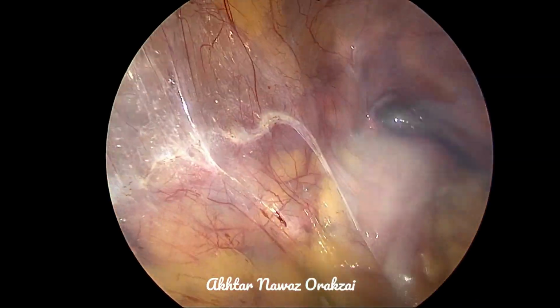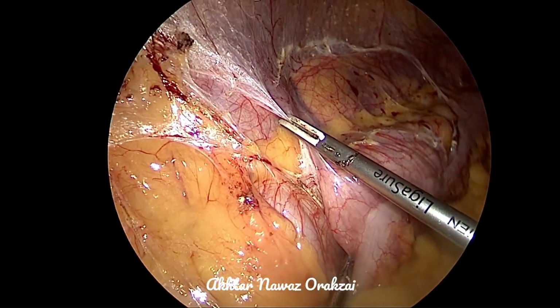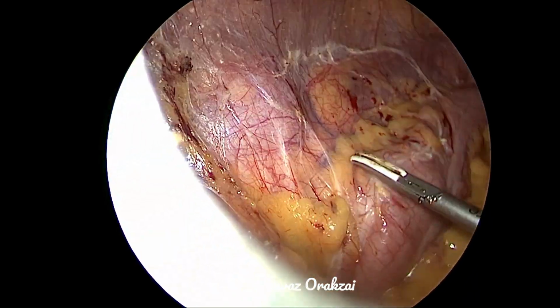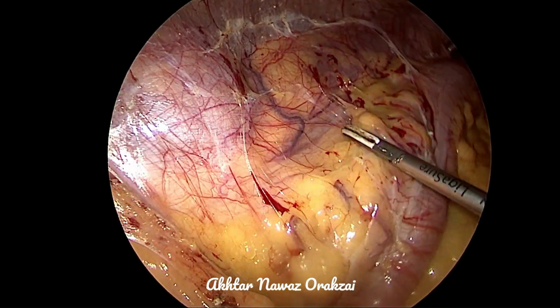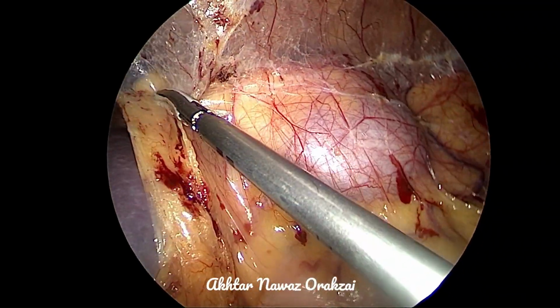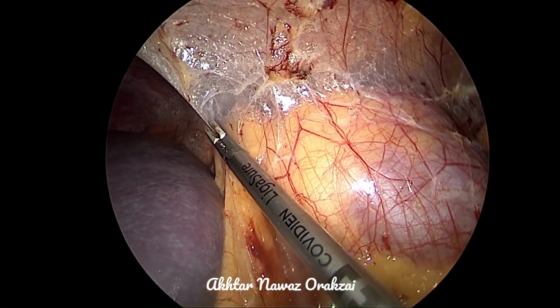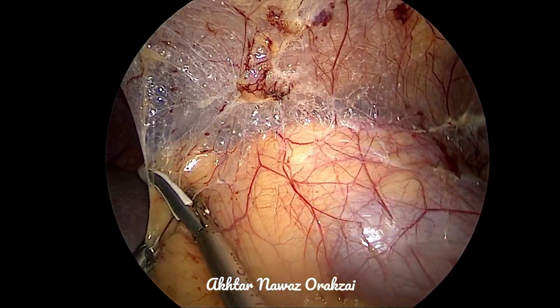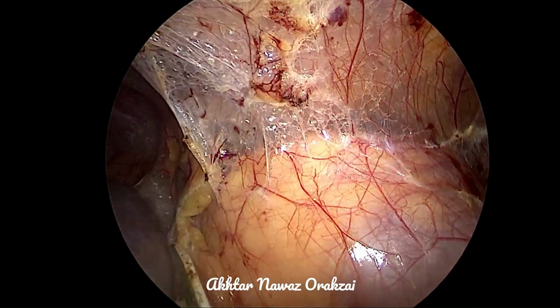Some may ask that if you are performing an adrenalectomy, a procedure which is performed on the adrenal gland, which is above the superior pole of the kidney, why are we going to mobilize the colon up till the pelvic brim? Well, the situation may vary accordingly, but usually we mobilize the colon up till the pelvic brim lower down, and we also mobilize the spleen up till the crus of the left diaphragm.